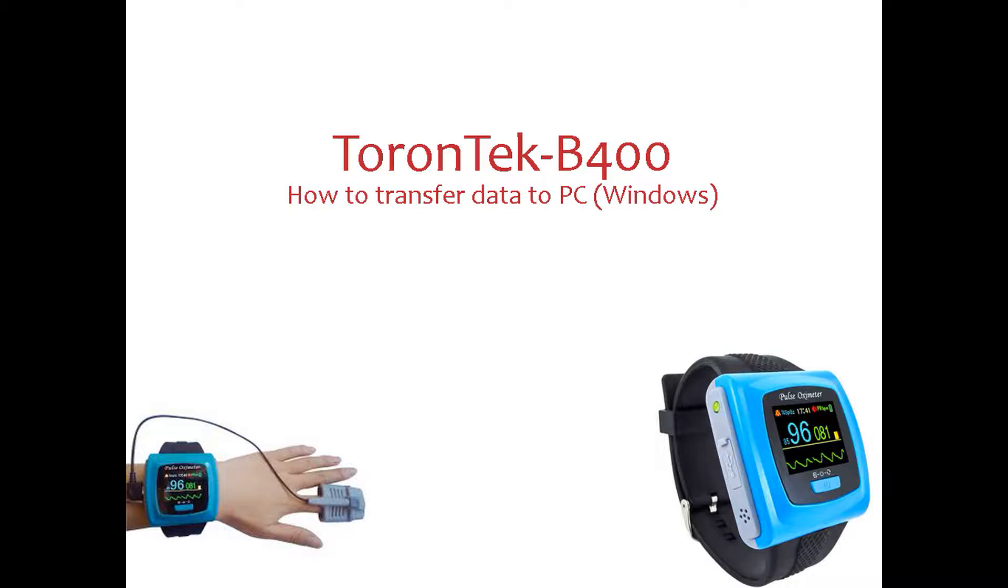Make sure you have already recorded the data on your ToronTek B400. Please refer to the related video on how to activate recording.